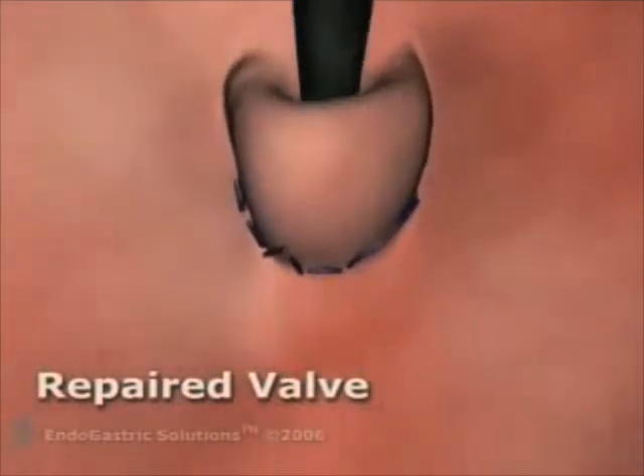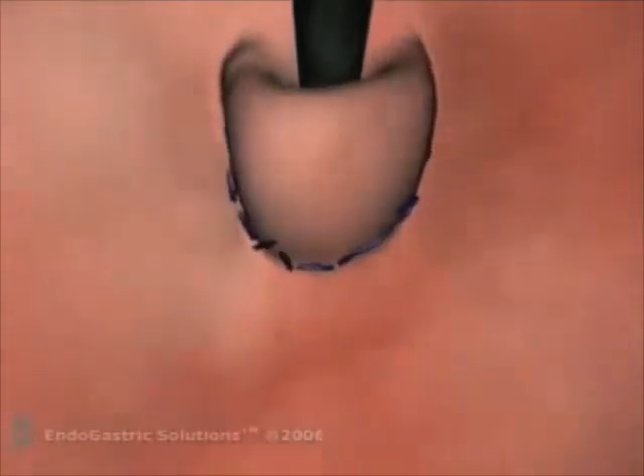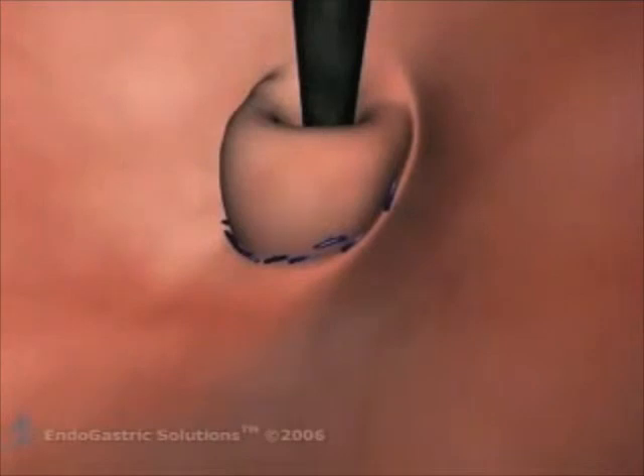It is repeatable, reversible, and in our limited experience, much easier to learn, and appears after 18 months to have surgical-like results.